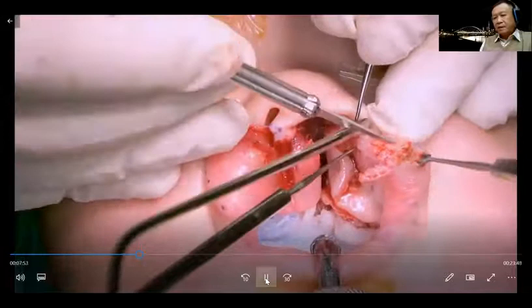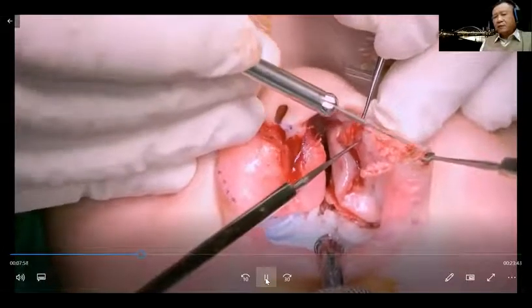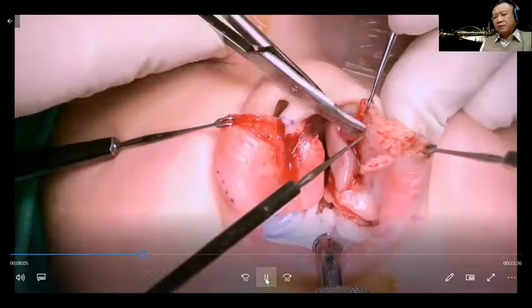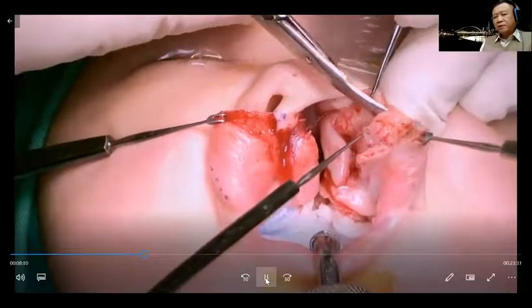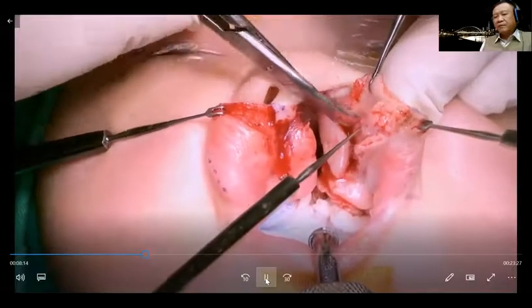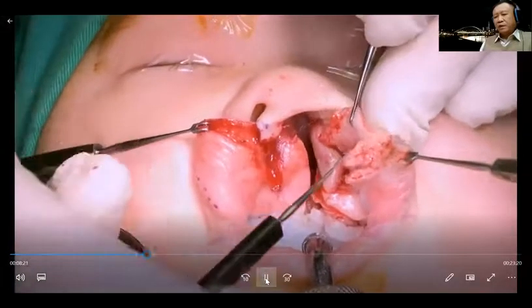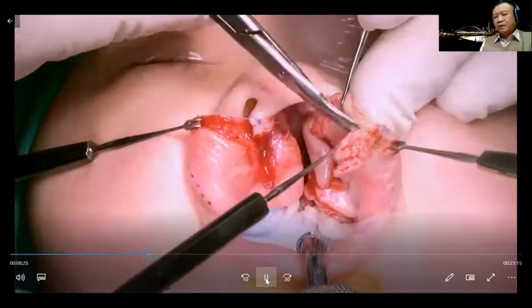So the three layers in the lateral lip segment are quite extensively separated and very delicate. And you can see here now again, a 65 knife to cut the subdermal area. So now I'm separating the muscle from the dermis, and I use my fingertip to provide sensation so that I can cut right in the subdermal area, so I can have a very good, healthy, robust muscle flap for reconstruction of the muscle.